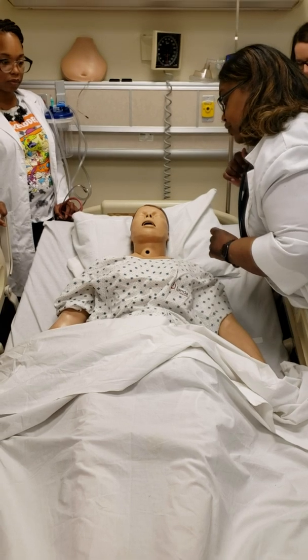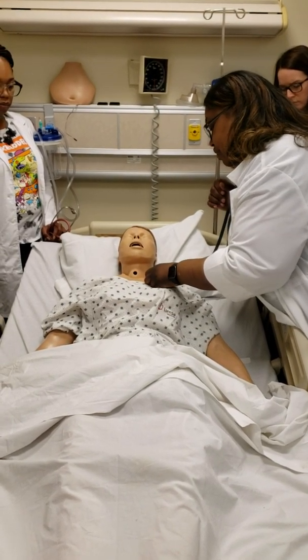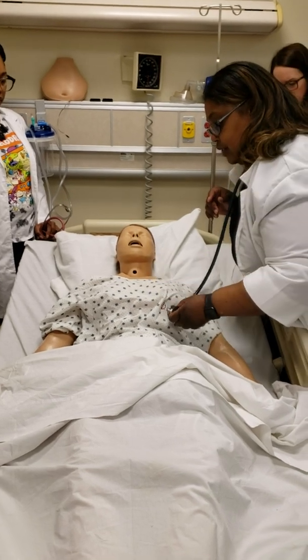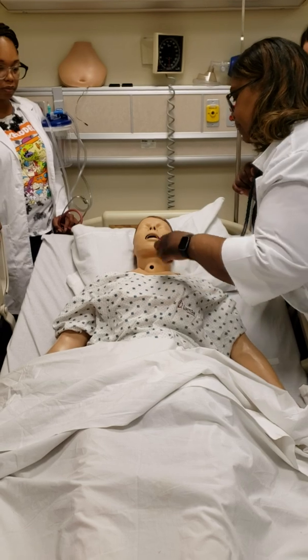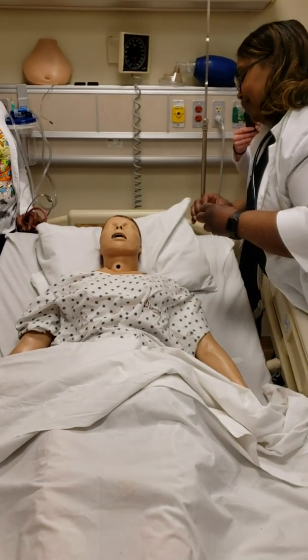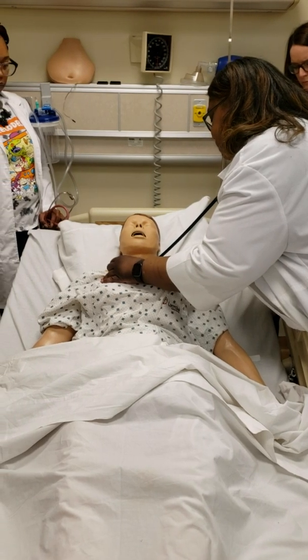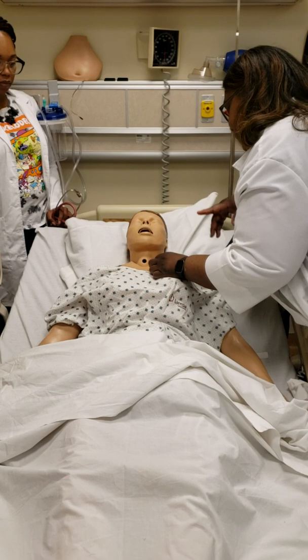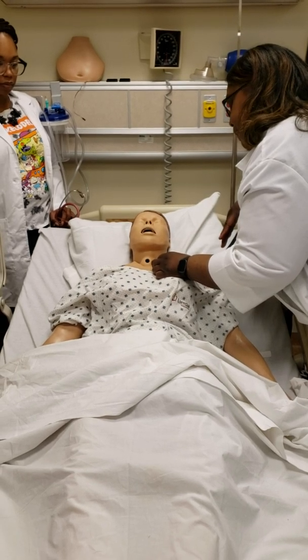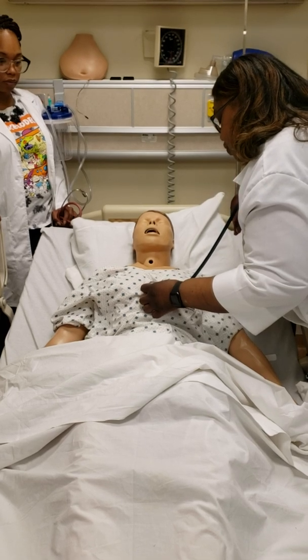Then I'm going to say I'm going to listen to the heart now. I'm going to listen to S2 at the base of the heart, where it's loudest. I'm going to listen to S1 at the apex, where it is loudest. Then I'm going to listen to my valves. I'm going to start with the aortic, second intercostal space, right sternal border. I'm going to do the pulmonic, second intercostal space, left sternal border. I'm going to do tricuspid, 4th to 5th intercostal space, mid-sternal.